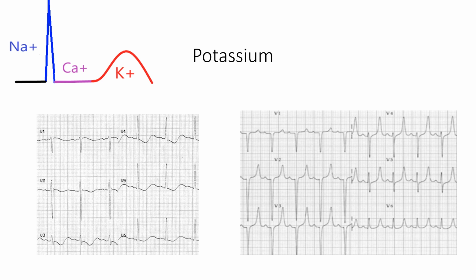And then on the right, you can see kind of the early signs of hyperkalemia. You can see the tall, narrow T waves because we have a hyperactive repolarization phase.